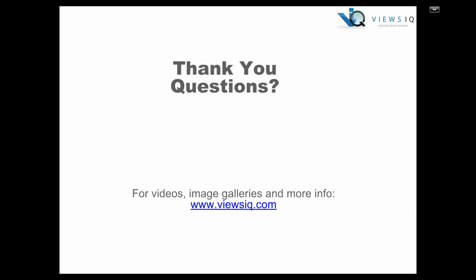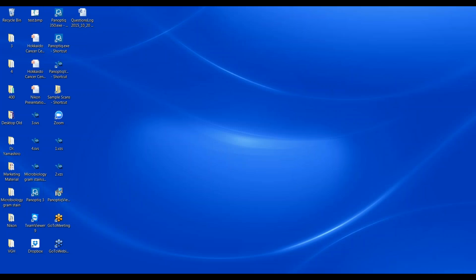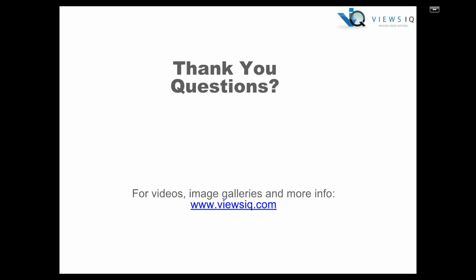Another question that's come in is, what applications has Panoptic been evaluated for? In addition to the frozen section study that I mentioned at UPMC, Panoptic has also been evaluated by UPMC for cytology and microbiology, as well as telehematology at Vancouver General Hospital, locally here in Vancouver. If anyone wants any more information about those studies, I'm happy to pass along the details, and we have a few more validation studies currently underway at Massachusetts General Hospital and some other institutions.